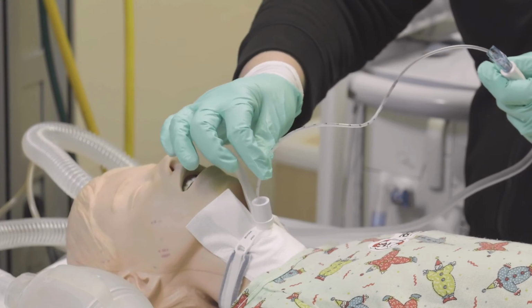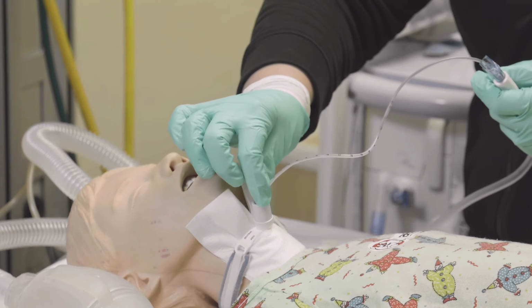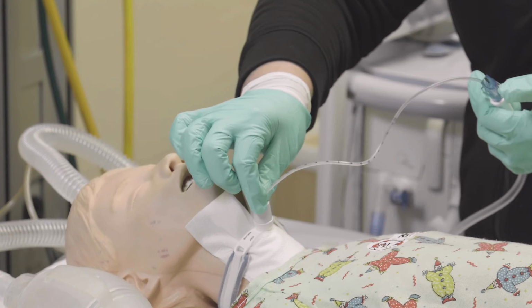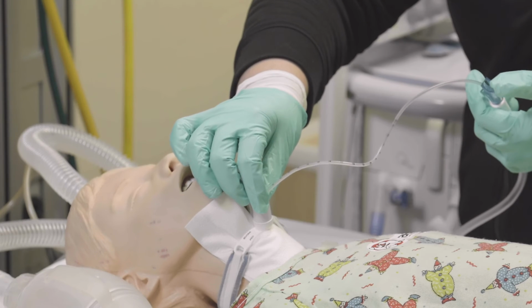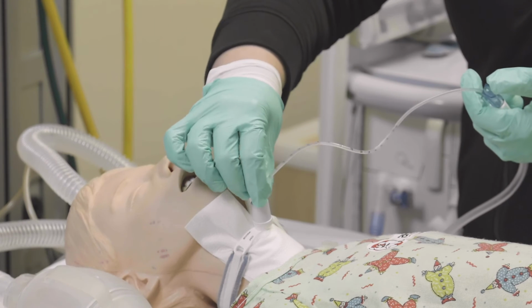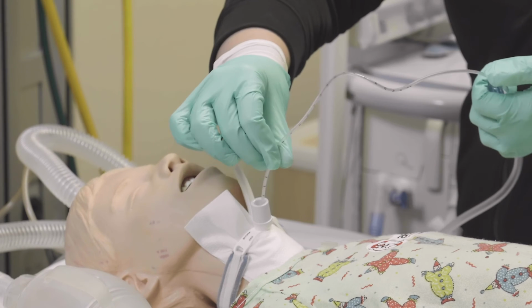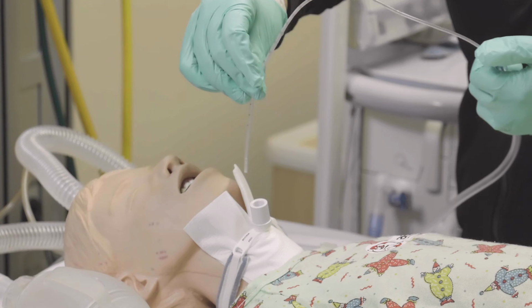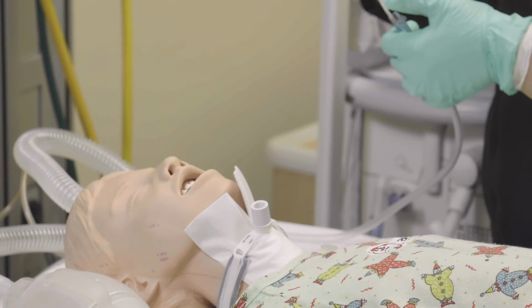Insert the suction catheter into the tracheostomy tube to the pre-measured length. When the pre-measured depth is reached, withdraw the suction catheter using a twisting or twirling motion, while at the same time applying continuous or intermittent suction. Limit the total suction time of each suctioning event to less than 10 seconds.